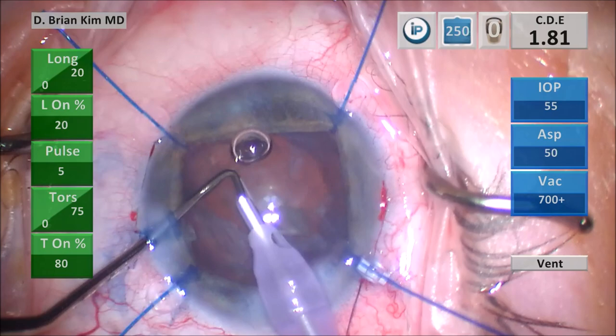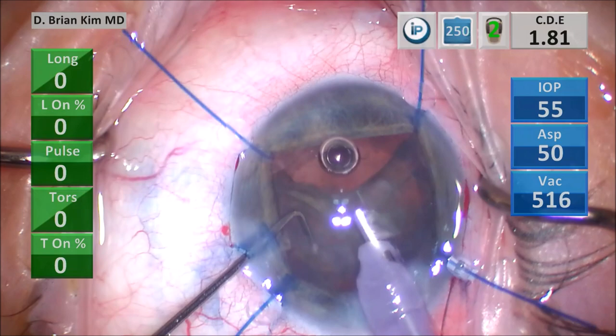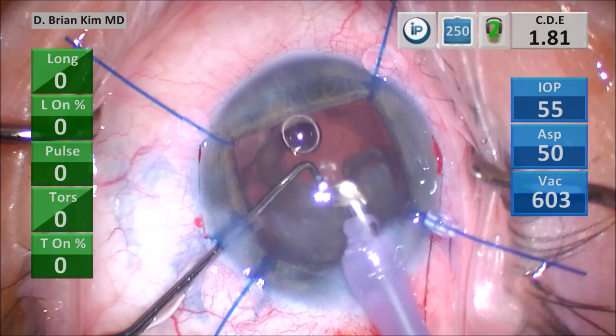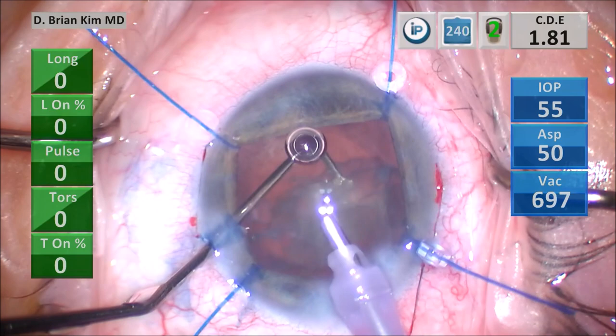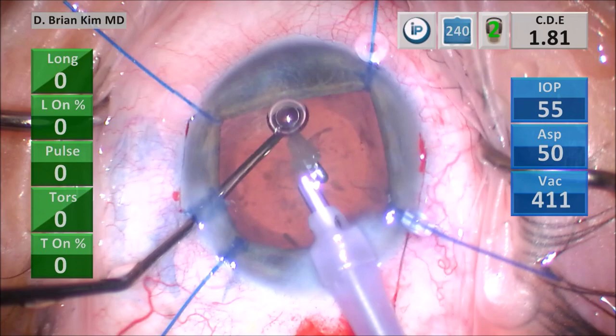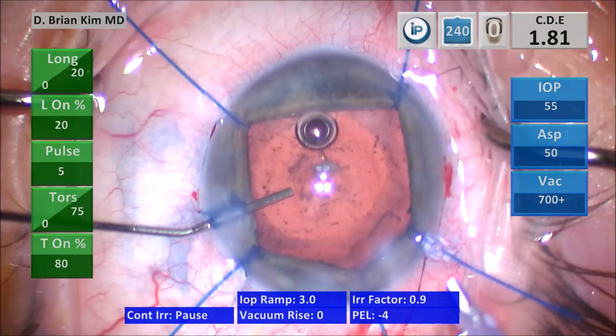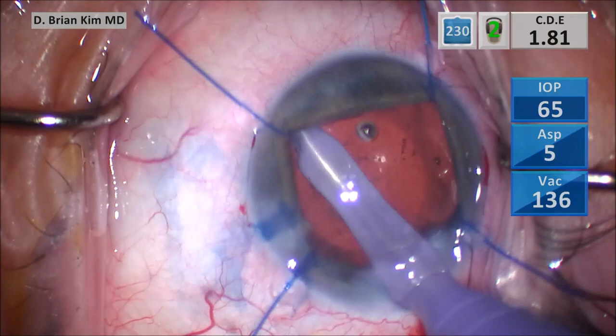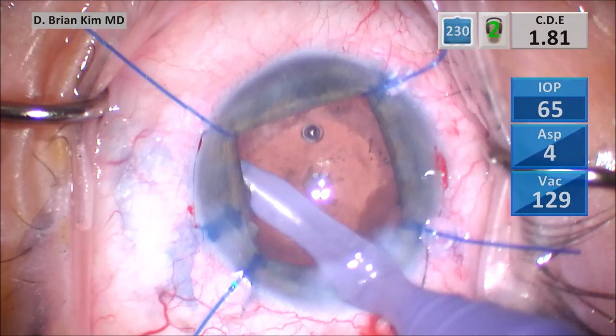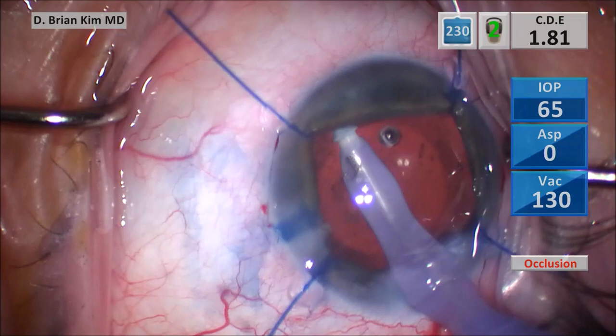I'm beginning to remove the epinucleus material, going up to the anterior rim, and you can see it starts to come forward. I use the chopper to help loosen up the epinucleus material and pull it out of the bag. As I remove the epinucleus, I place the chopper deep in the bag, making sure the posterior capsule doesn't come forward. This is particularly important with silicone oil pushing the posterior capsule upward. I push BSS into the eye, take the phaco tip out, and switch to the I&A, maintaining chamber stability as I begin removing cortical material. It's a fairly clean bag, but there's quite a bit of capsular fibrosis, which is not uncommon in post-vitrectomized eyes with silicone oil.